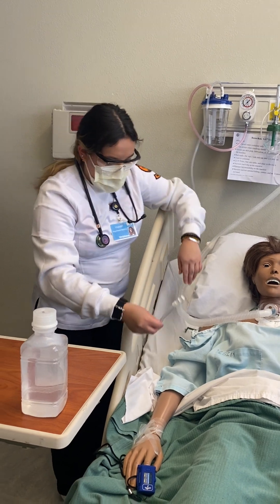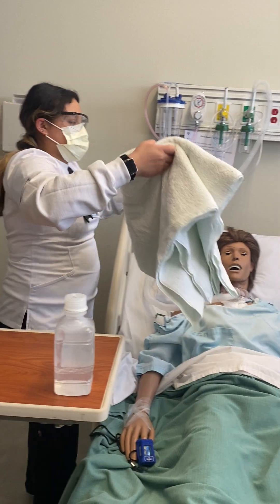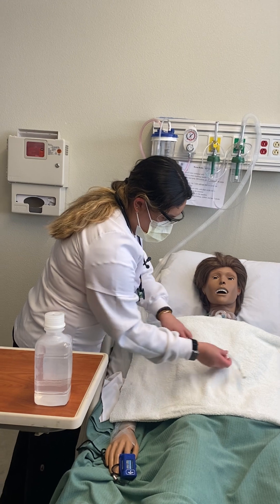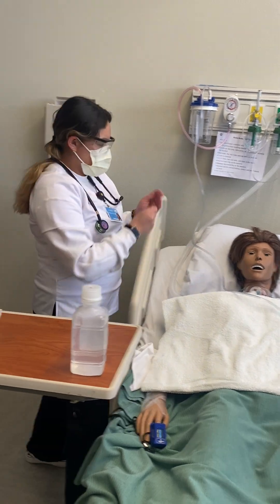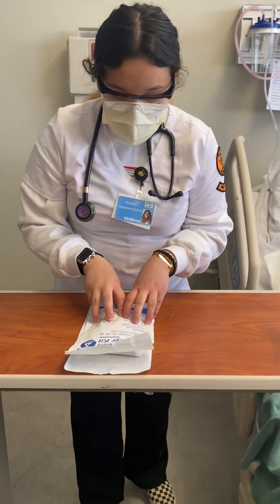I'm going to go ahead and grab a hold of it. I'm going to put a towel over you — is that okay, Mrs. Smith? Yes. I'm going to put it on you just to protect. Then I'll lay the suction tubing right over here. I'll lay it right there. I'm going to perform hand hygiene again. I'm checking my kit — it has not expired, it's still good to use. Then I'm going to go ahead and open it.